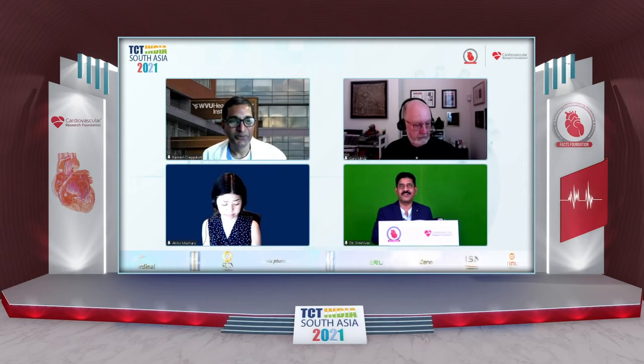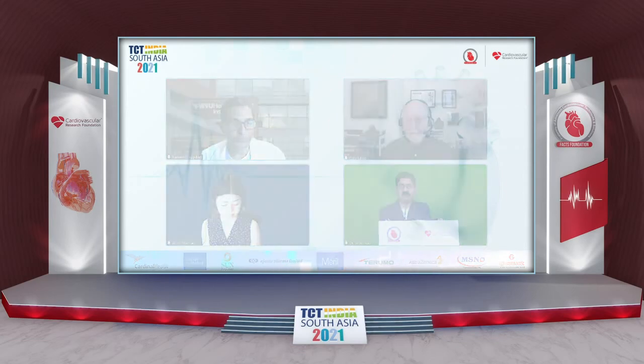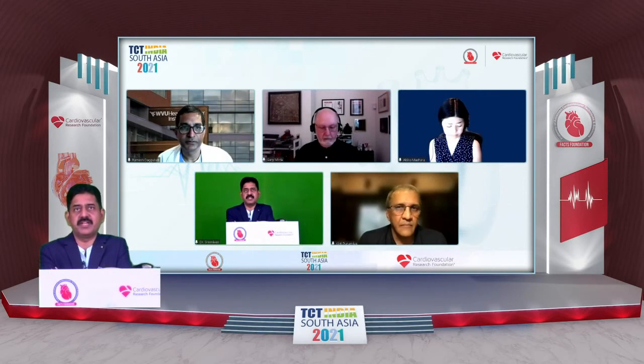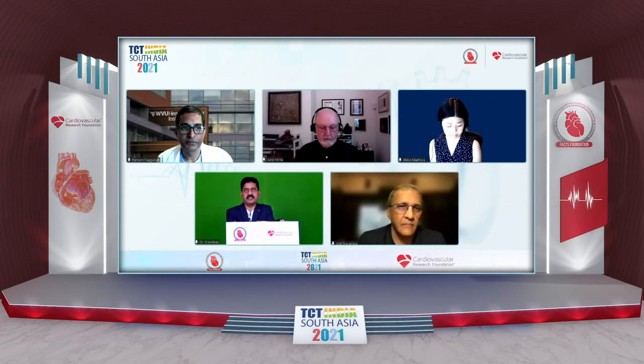I don't think you really have to do a lot technology-wise. It's just a push of a button, and you can get the virtual histology. Colors appear, but do they always correlate with the clinical picture? I think Gary or Akiko could comment on that.